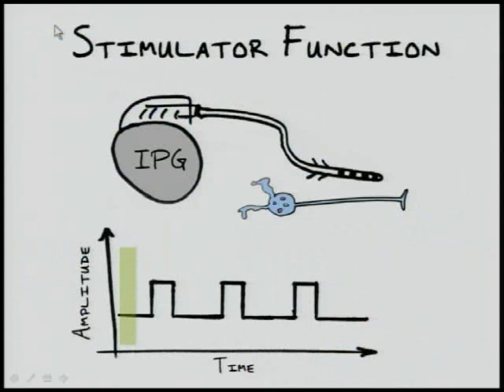The device only pumps ions when it is on. This is represented in the stimulation signal by the upward steps in the waveform. Watching the green bar as it moves along the stimulation signal and watching the electrodes demonstrates how the device pumps out charge in an on and off fashion.